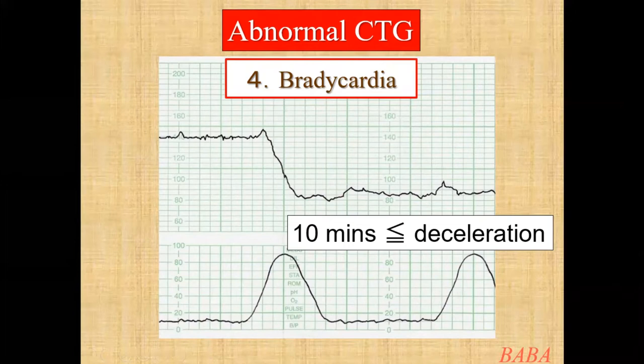During bradycardia, fetal placental circulation is reduced. That means that the fetus cannot receive sufficient oxygen from the placenta, and the fetus will become more and more hypoxic. You should consider immediate intervention to prevent fetal death or permanent brain damage, especially when the baseline is below 80 BPM.